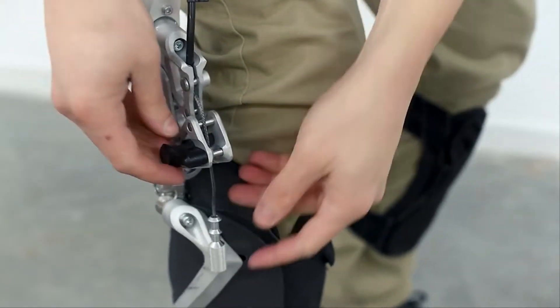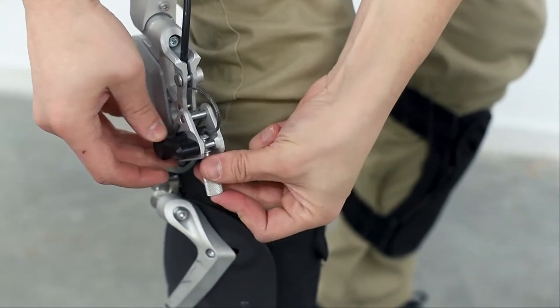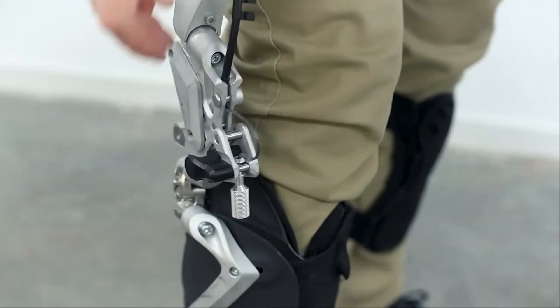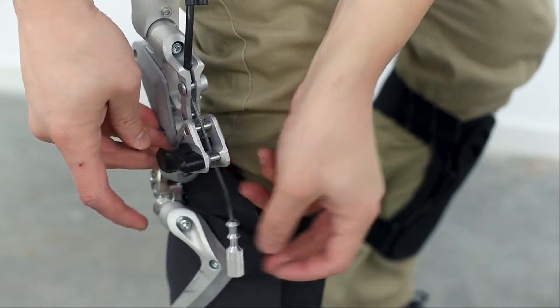To decrease assistance and delay activation, pull back the spring-loaded knob and release it to catch one of the two notches on the knee cable end, with the farthest one providing the least and most delayed support.